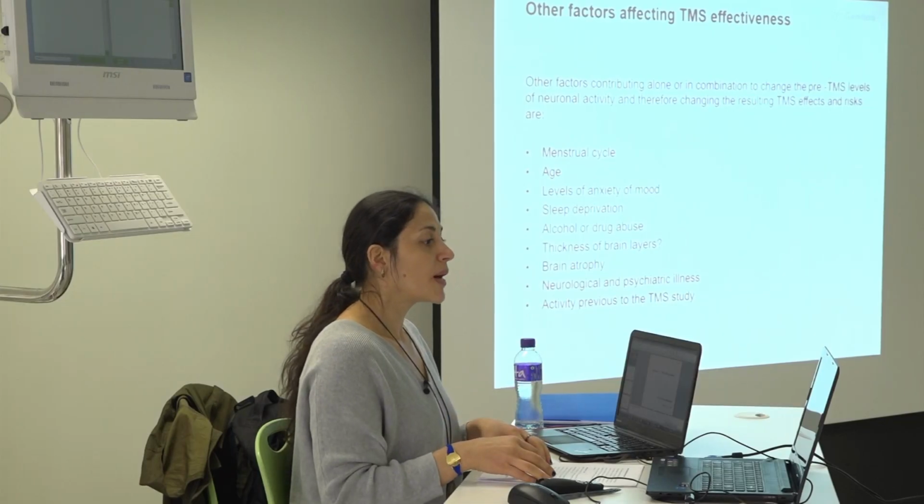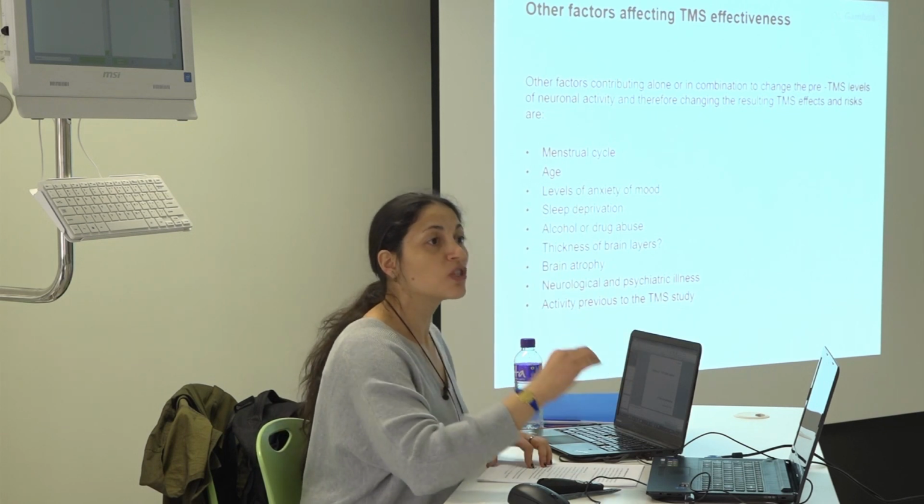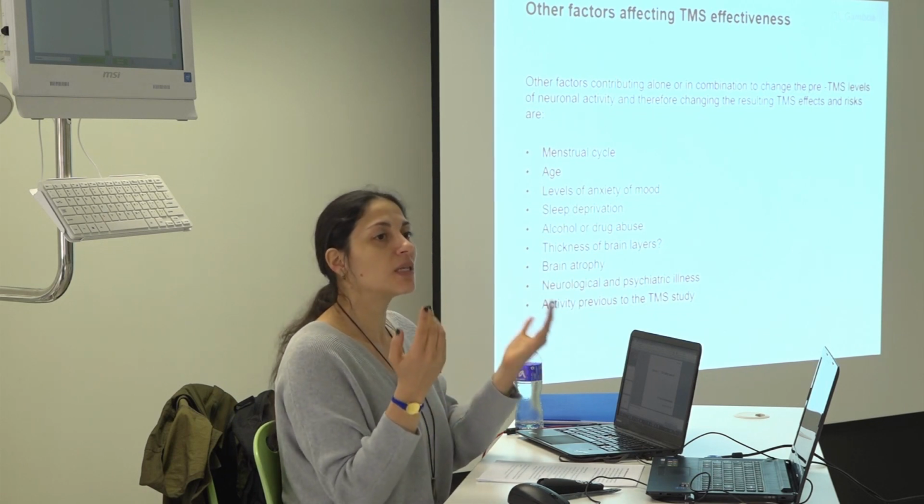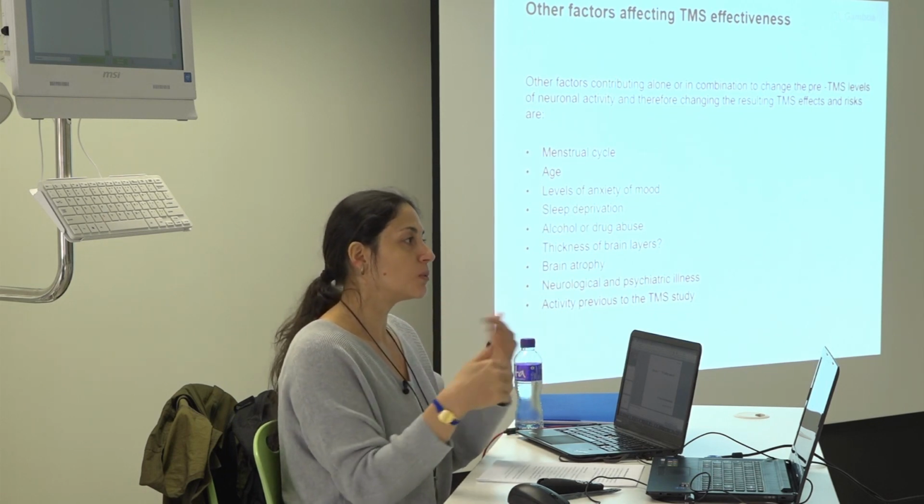I'm a little bit surprised. In the lab, I am, but it is definitely stated in the consensus. It's not a risk. It's not like the person suddenly will have more blood or whatever. No, but the outcome will be different because there is an interaction. You are measuring excitability. There are some changes going on, so you will have some differences in this measurement. So you want to consider not doing it.